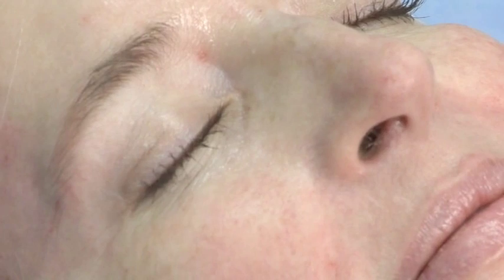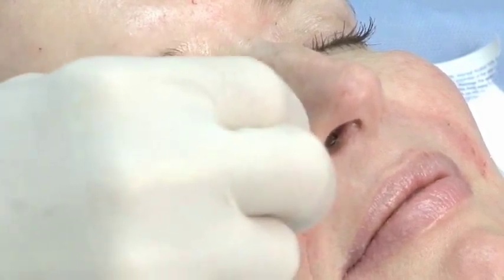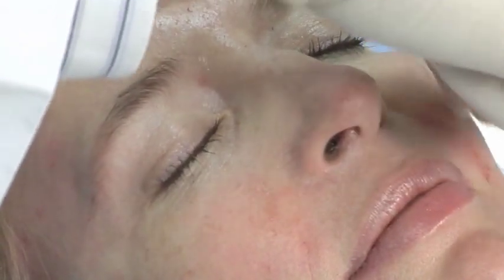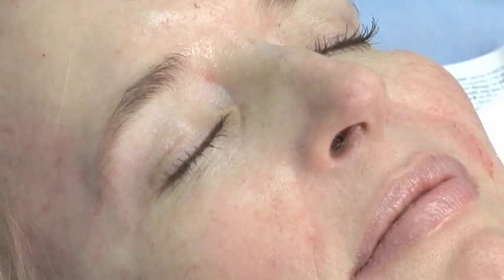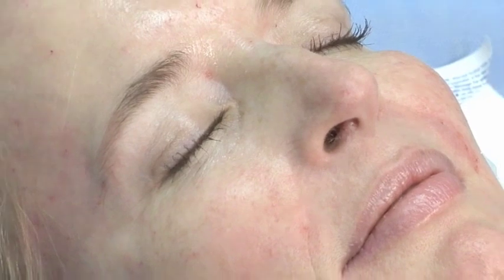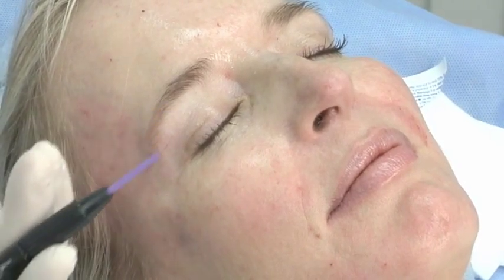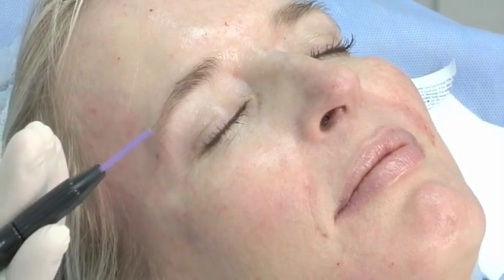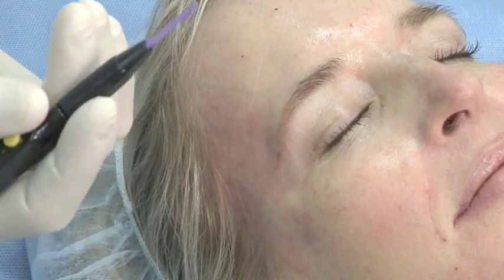What we're going to treat on Robin today is some little facial telangiectasias. This is a very common spot, especially the ones that are adjacent to the ala and the cheeks as well. I found a very useful device to be the Elman radiofrequency ablator. I use a very, very thin wire that they provide for this, and they have several machines and models that all do a very nice job of radiofrequency ablation of these facial telangiectasias.